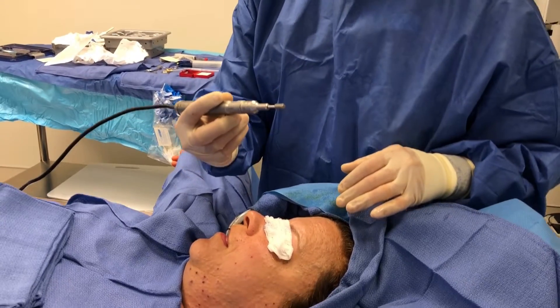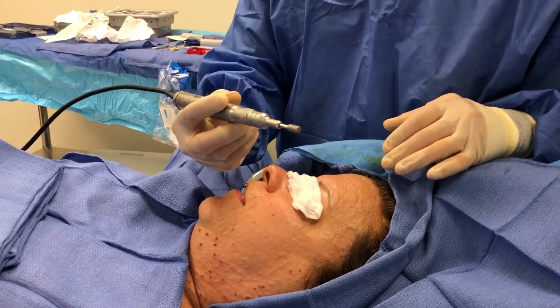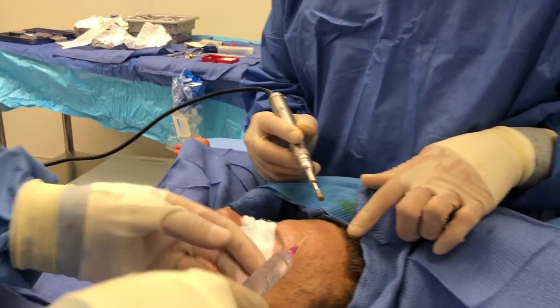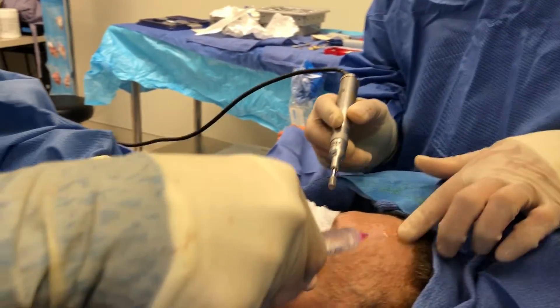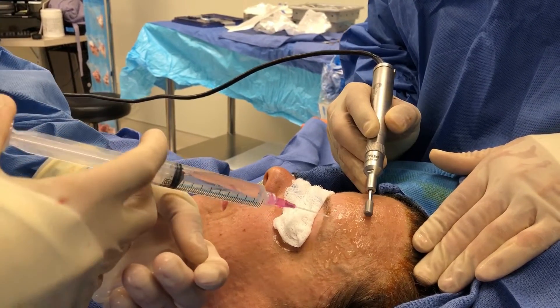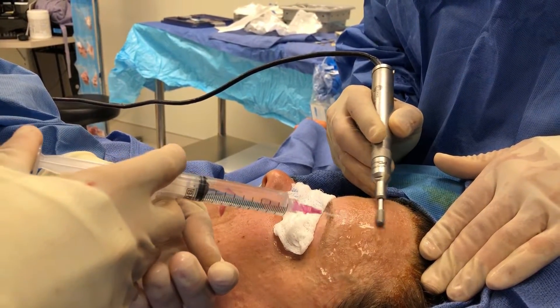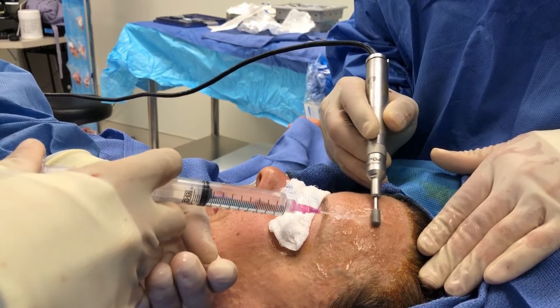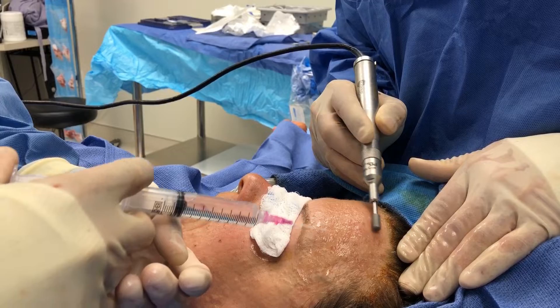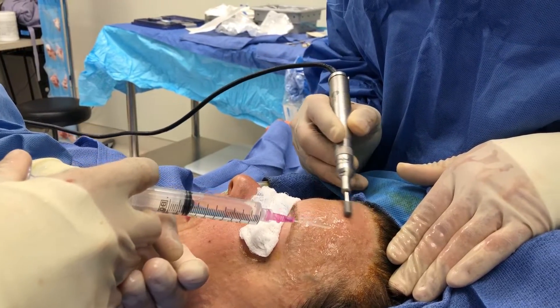We fire that up, and then give me a little bit of irrigation right here, just sort of all across the forehead. I like to get that wet to begin. And we just basically start to sand the outer layer of epidermis and dermis to where we get a more even surface.